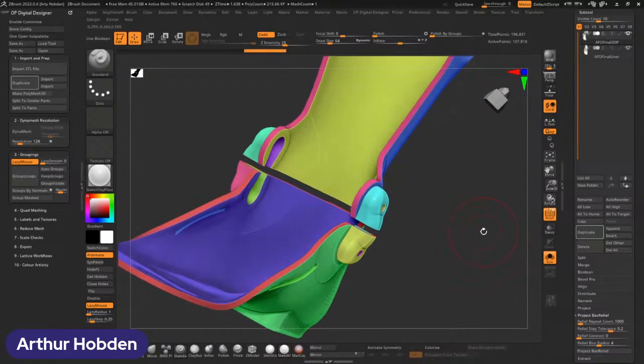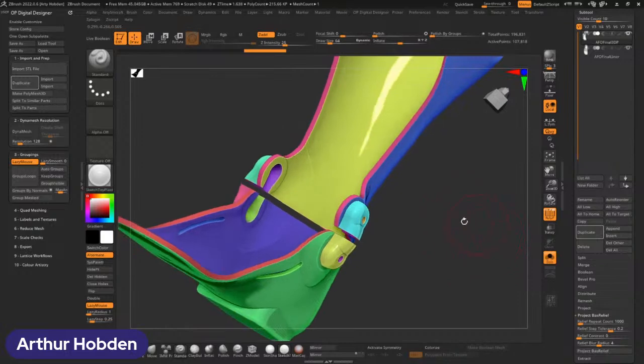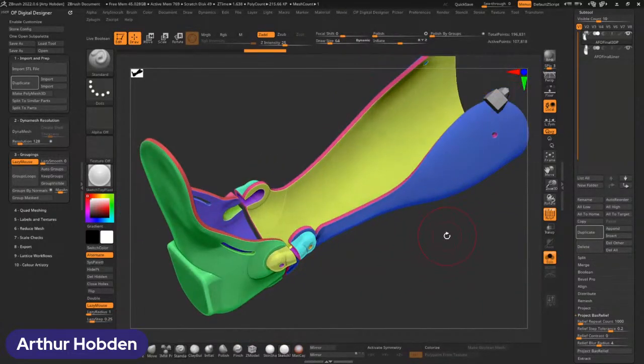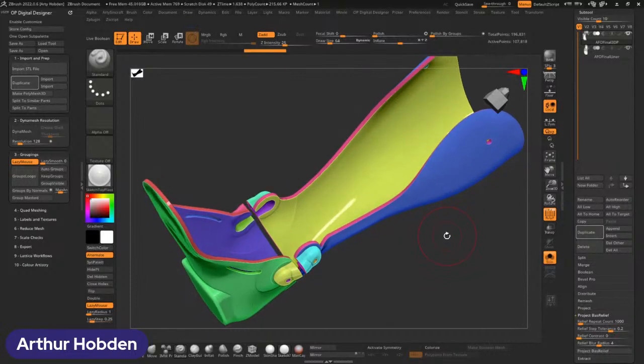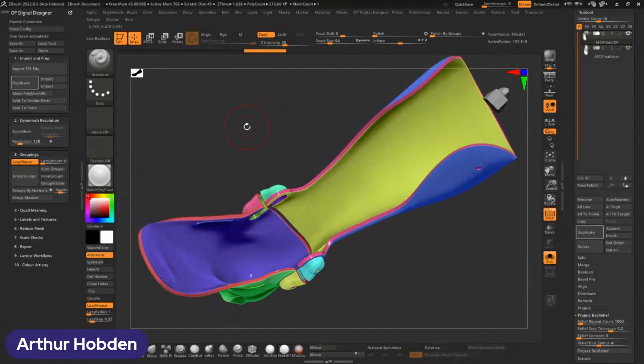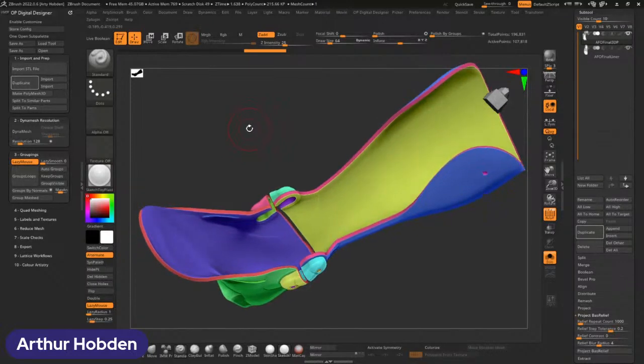Luke asks, have you used the Ethermix 3D Scanner for the iPhone? I haven't used that before. Most iPhone technologies are all the same. In the sense of their quality, all of it gets throttled down to the iPhone's actual camera. There's no one software that will work better than the other. I have used iPhone scanners. They all yield very similar results.